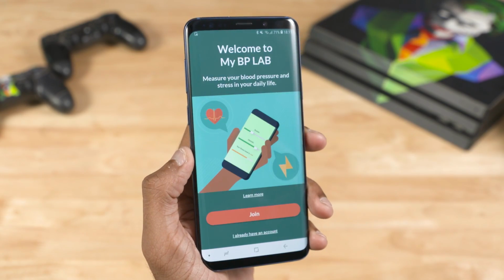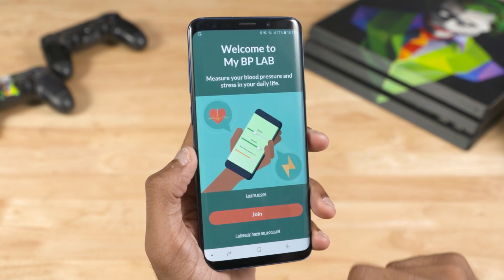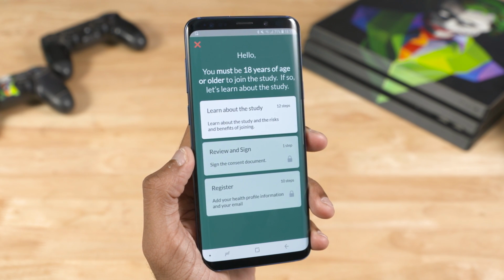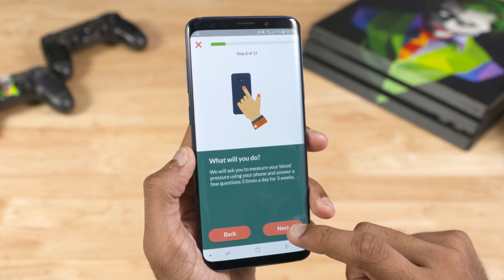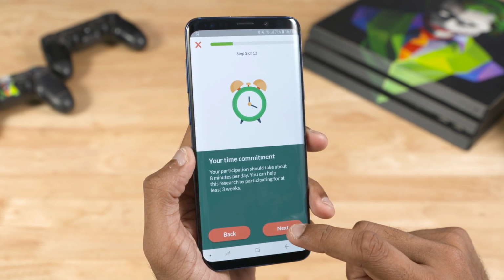Now, let's come to the app itself, My BP Lab. Fire the app up and you get greeted with a brief description of what the app actually does. This is basically a research being conducted on stress patterns and blood pressure, and measurements from the app are not to be used for medical purposes.